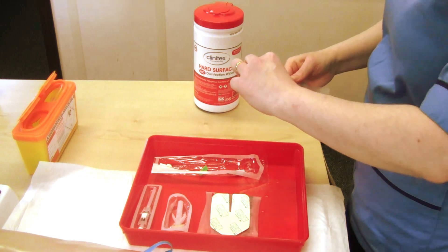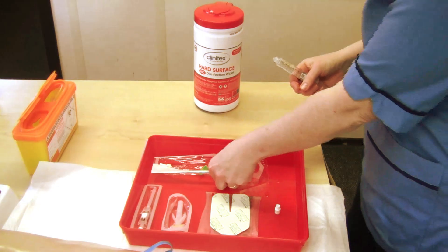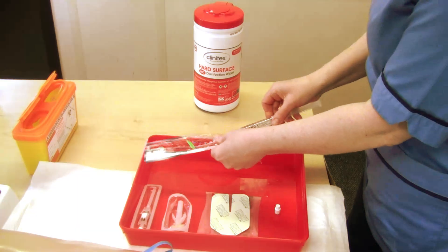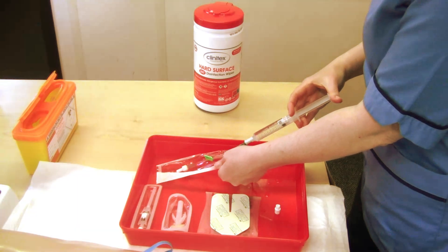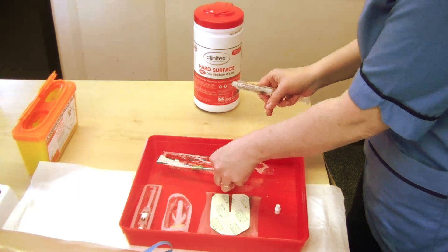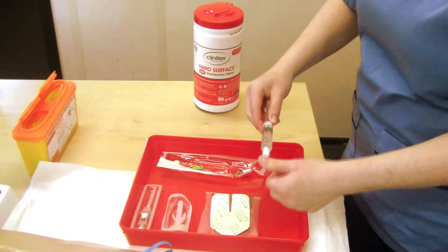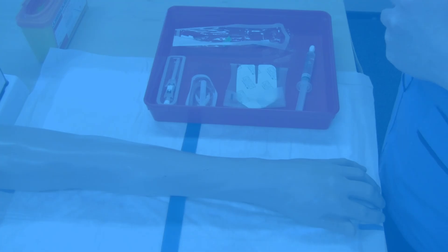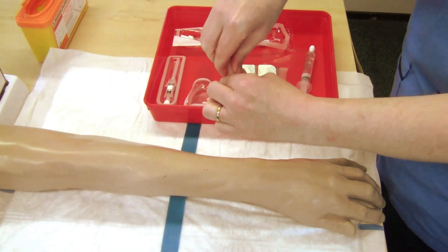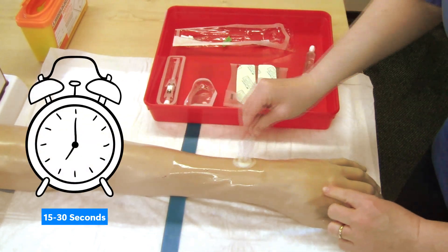If using an extension set, ensure that you prime the line prior to use using ANTT. Clean the chosen site with chloroprep using up and down, back and forth strokes for 15 to 30 seconds and allow it to dry.